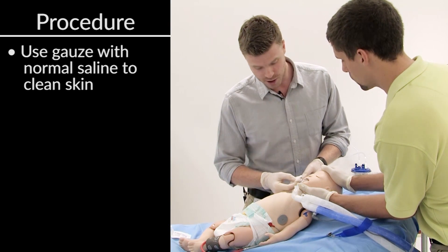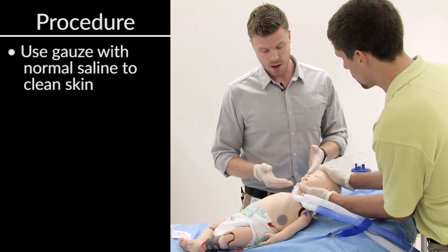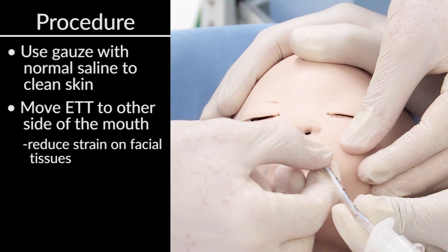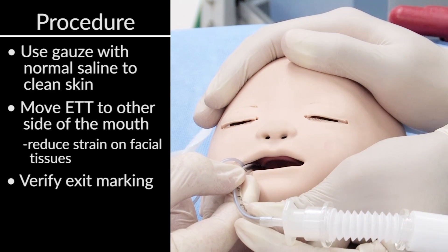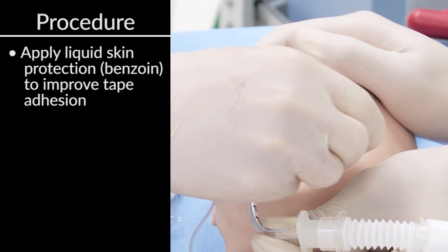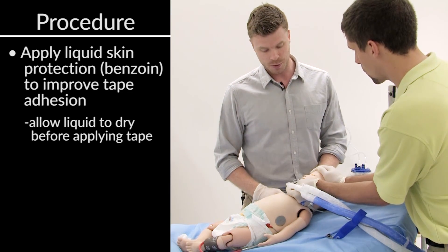I have some gauze prepared with some normal saline and I'm just going to give the face a quick wipe to get rid of any sweat or grime that's built up over time. Another thing that we do when re-taping on occasion is move the endotracheal tube from one side of the mouth to the other — doing so can reduce the strain put on the tissue. We're going to go ahead and do that now. Verifying the position, we're still at an exit marking of 11, which is appropriate for this child. I'm going to apply the skin protection liquid that will prepare and help the tape stick better. Make sure you allow this to dry before you put the tape on, otherwise it won't stick.